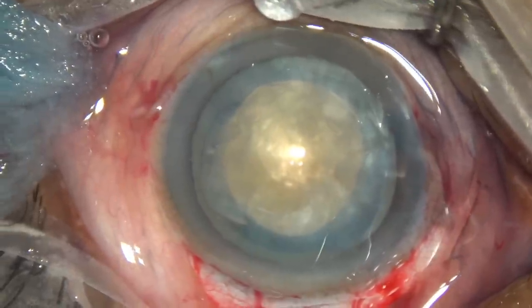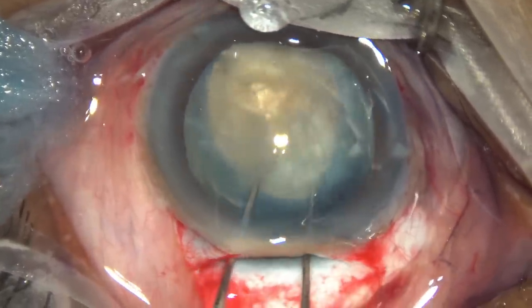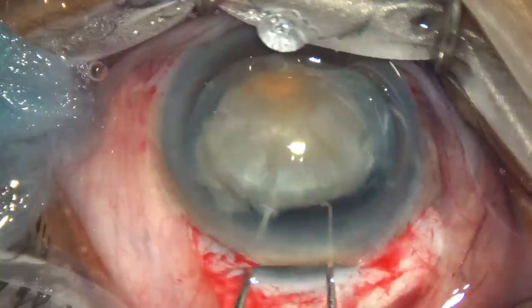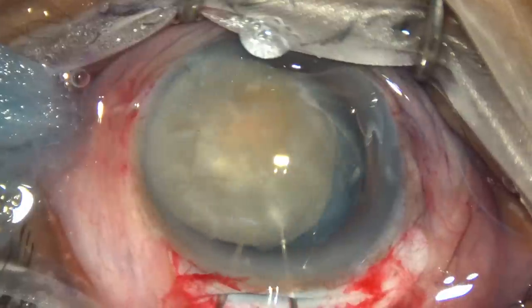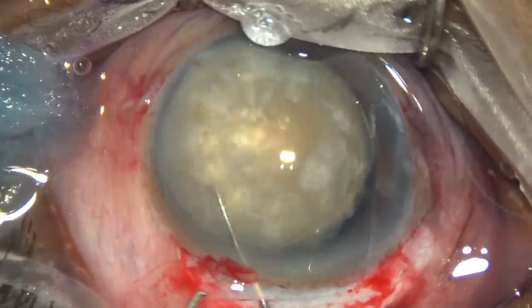We go with two hooks, push the nucleus down. One hook is below the nucleus, the other one is dialing it, and it comes out. We are getting it like this.